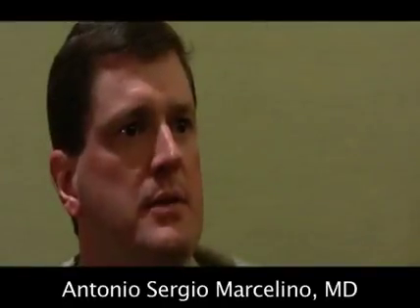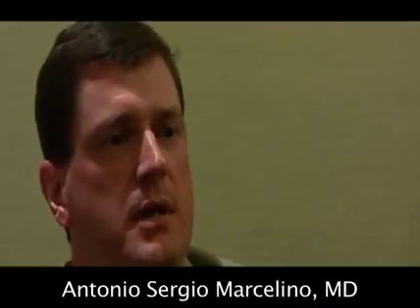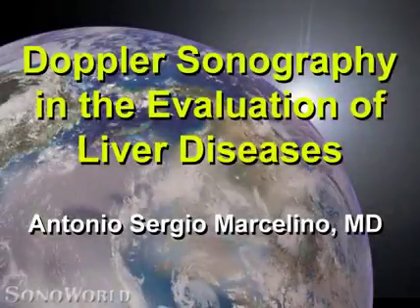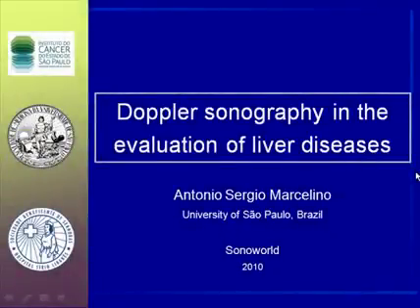My name is Antonio Marcelino. I work as a radiologist specialized in ultrasound, and I'm going to talk a little bit about ultrasound Doppler evaluation of liver disease. Doppler sonography in the evaluation of liver disease.